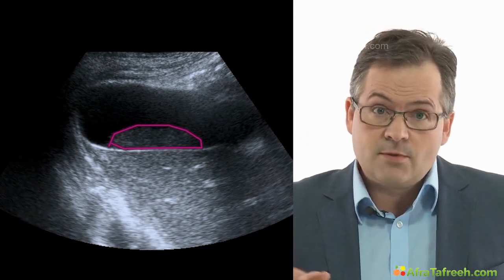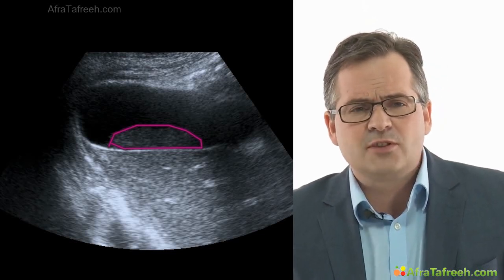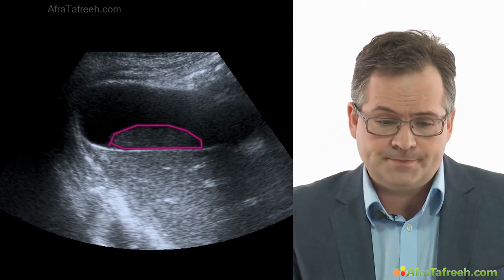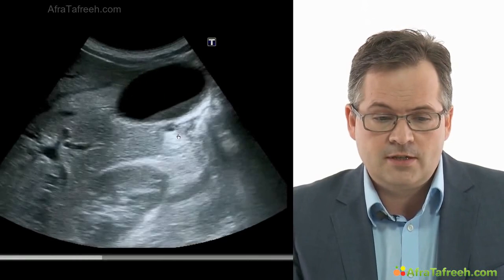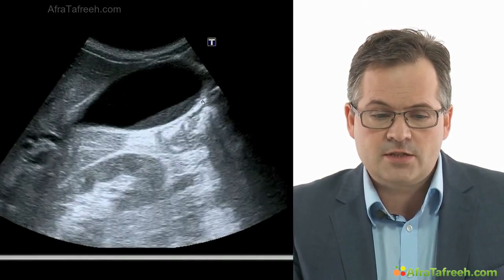Often gallstones will develop from this sludge. Sludge is also a sign of a reduced function of the gallbladder and a blocked drainage. So on the next clip you will see two problems. Here we see the sludge.